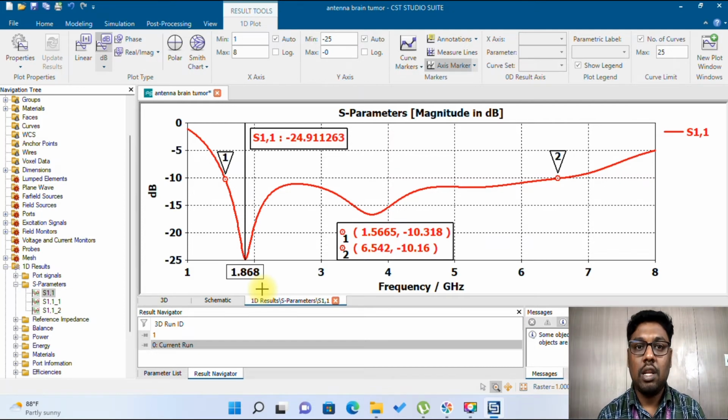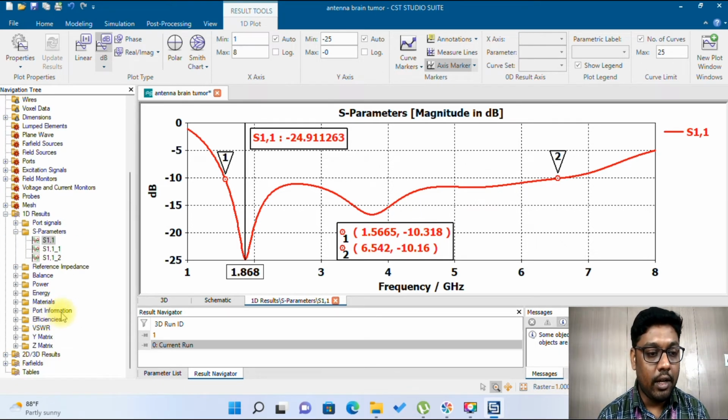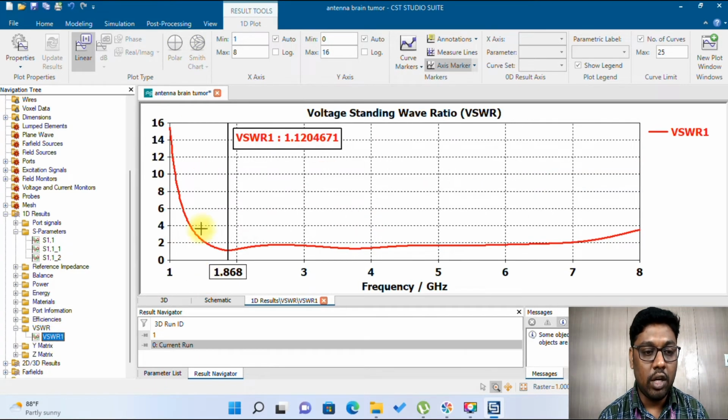But if you are considering brain tumor detection, definitely we have the skin and other things, the skull is there, then different layers are there, cerebrum, different things are there. So the tumor can be somewhere inside the brain. In that aspect, the signal needs to penetrate through all the different layers. So that's why we are focusing on the lower band of this UWB. So this is the S11 response, and the later part is that we will look into the VSWR kind of results.